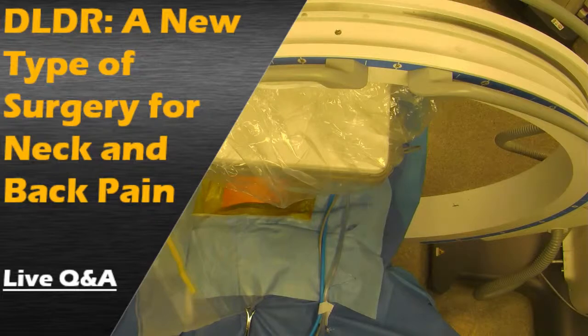Now our patient has COPD, so he's going to be as minimally sedated as we can make him. We don't want to have him obstruct his airway in any way, so I'm going to be using a lot of local and trying to keep him comfortable without putting him deeply sedated.